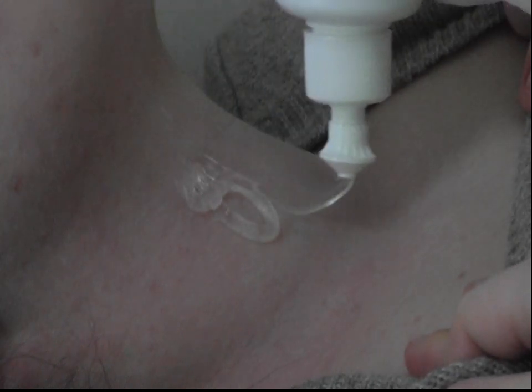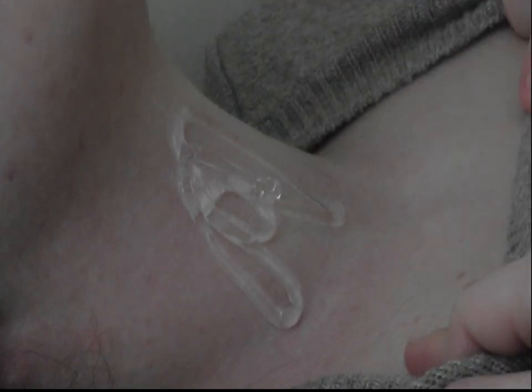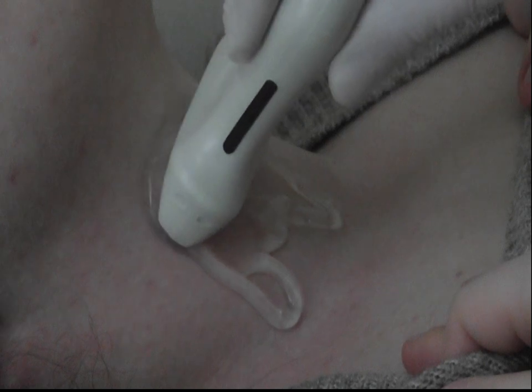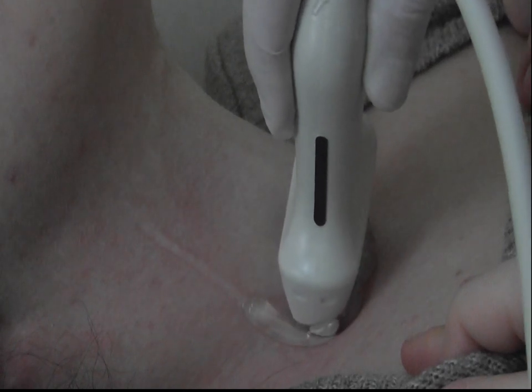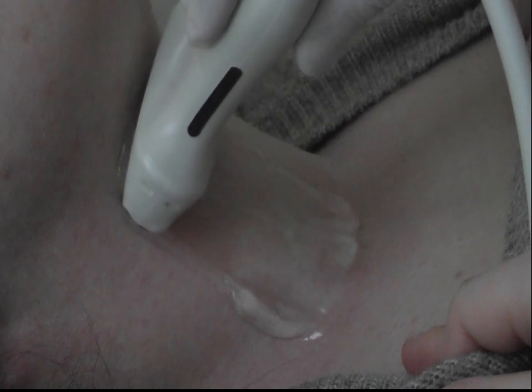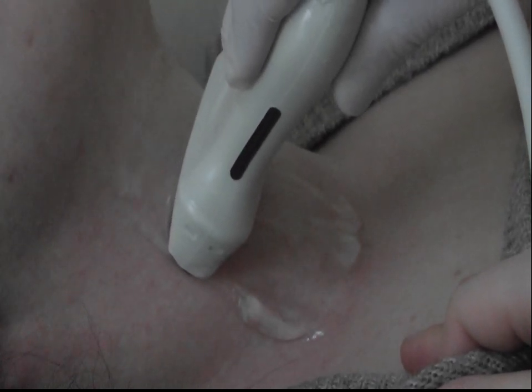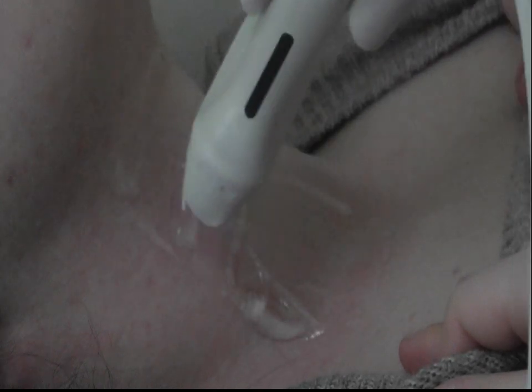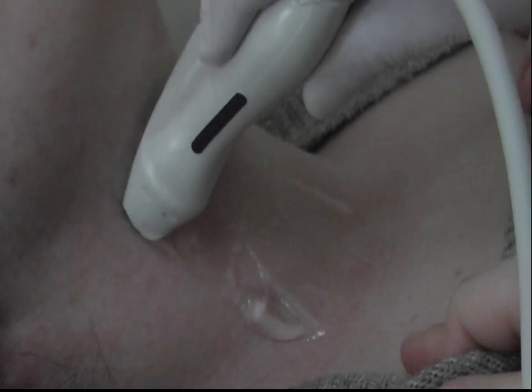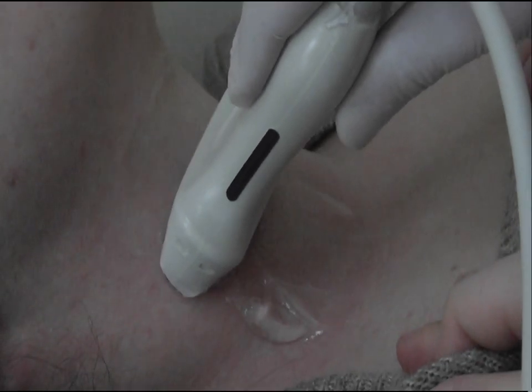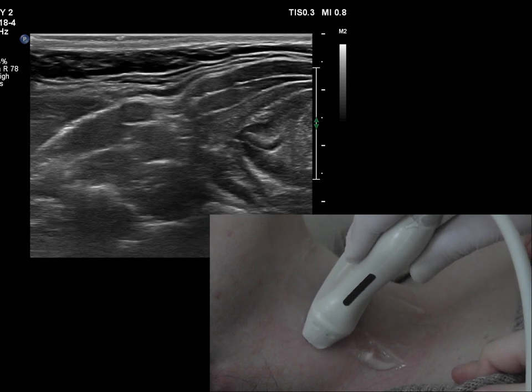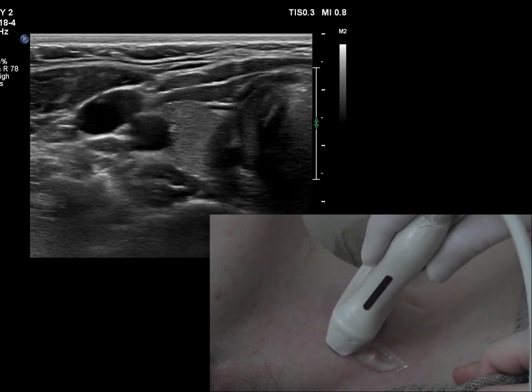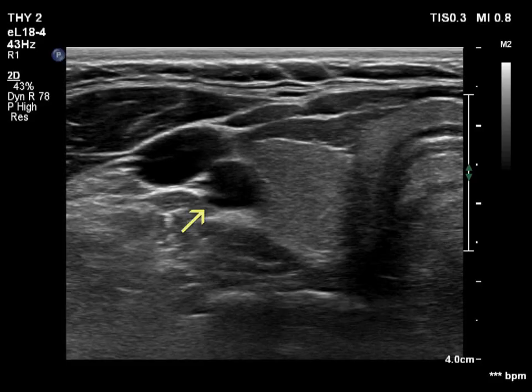Let's see a video. First, we apply an abundant gel to the patient's neck — during the examination we may need to apply gel again. Then we place the probe high on the neck in transverse position. Try pushing the probe a little harder and ask the patient to tell you when the pressure is uncomfortable. We look at the probe and move slowly down and then up a few times — this is to avoid having to look at the transducer too often during the test. Now place the transducer high on the neck, surely above the upper pole of the thyroid, and slowly move the probe down. Pay attention to the two anatomical reference points: the carotid artery and the trachea.